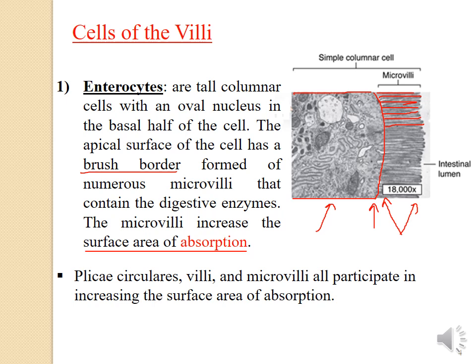Now, so far we talked about the presence of folds. We have folds in the small intestine. We have villi in the small intestine, and we have microvilli.